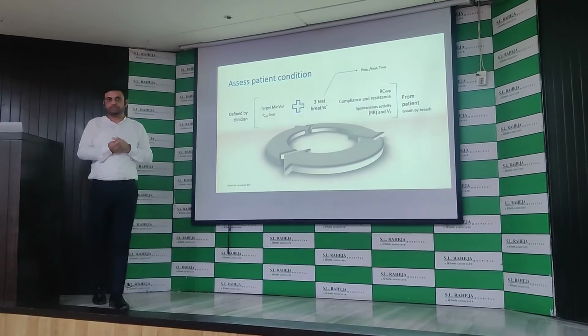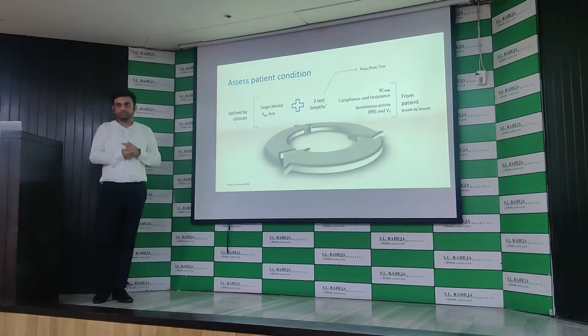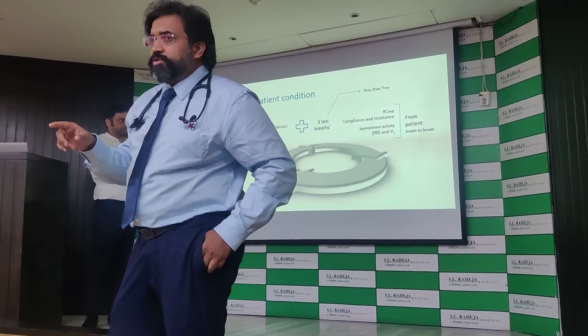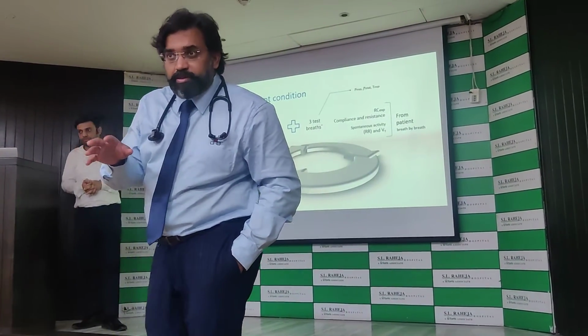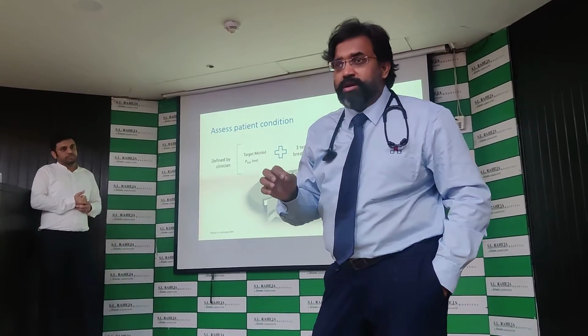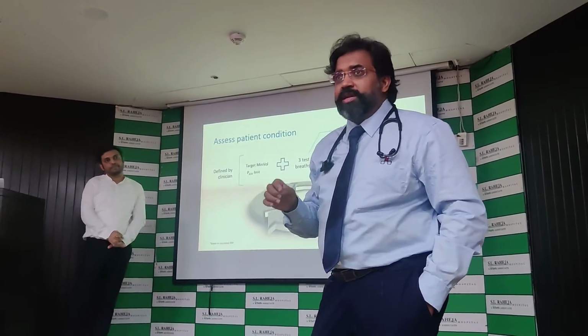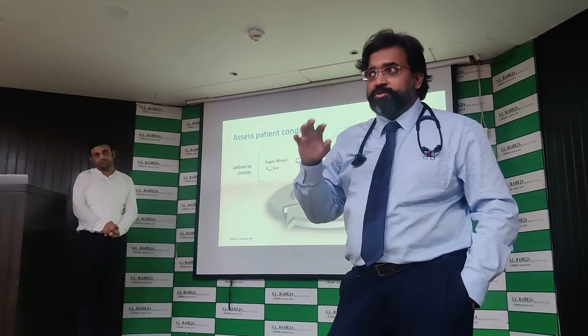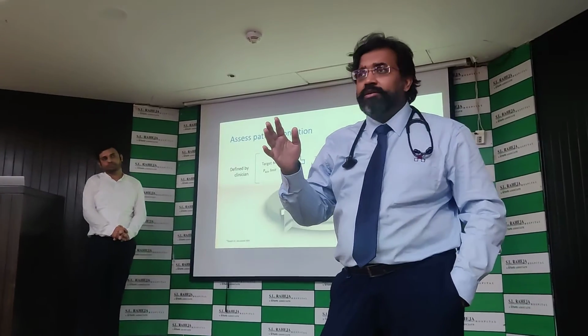I don't know, there is another ventilator setting called PRVC on the ventilator, pressure regulated volume control. All these work on the same principle. Whenever you do any measurement in the ICU, let it be ultrasound, let it be compliance, let it be plateau, you always do 3 measurements, because the average of 3 measurements is what we actually look at to understand the measurement.